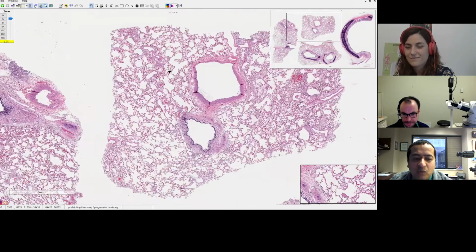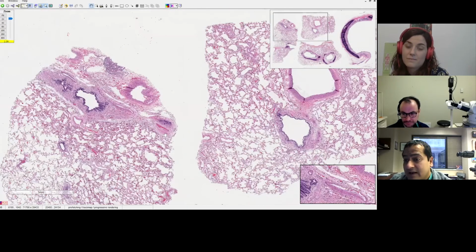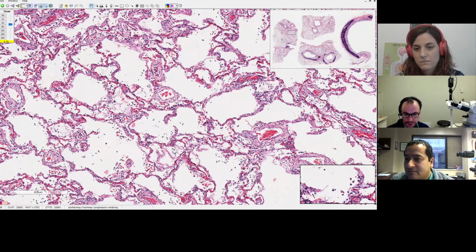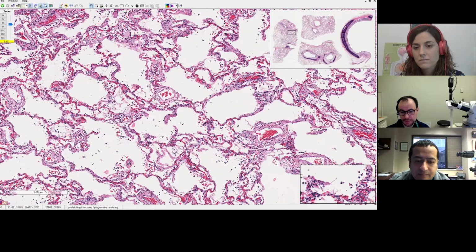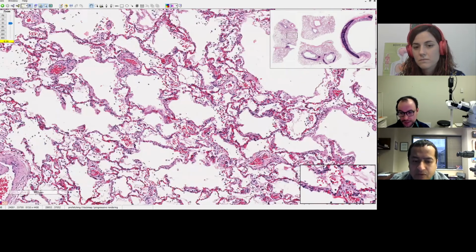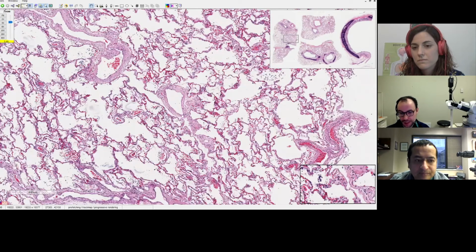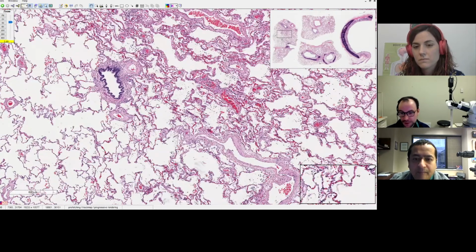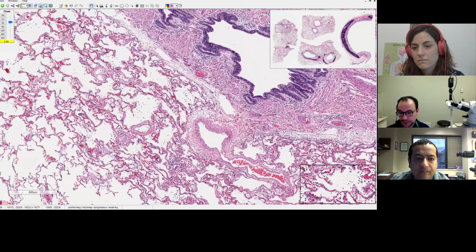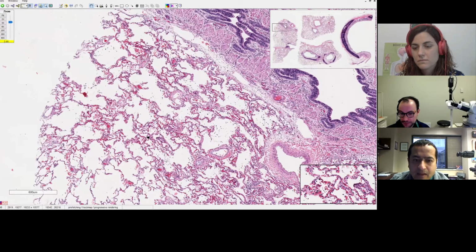But it certainly shows you what could have killed this patient. The DAD for sure is a good cause of death. If not an etiologically good cause, it is definitely a good pattern that would cause death. In other words, this explains why this patient might have died of a pulmonary illness. But histologically, this is really no different than the cases we saw last year with the vaping associated lung injury, right? In your autopsy series that had DAD. So I think it just highlights once again that the lung has a limited way in which it can respond to injury. Whatever the insult is, the lung responds in a very similar way, whether it's viral or an inhaled toxin. You can get organized pneumonia or DAD, and they histologically look all the same to us under the microscope. That's correct.